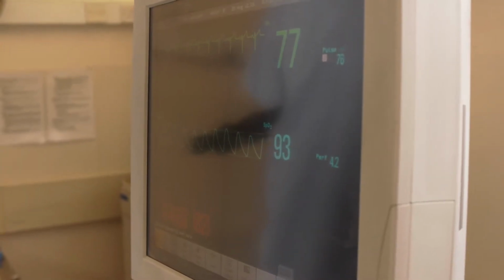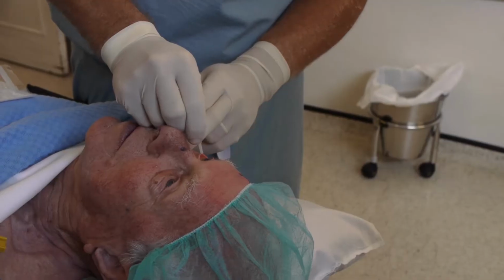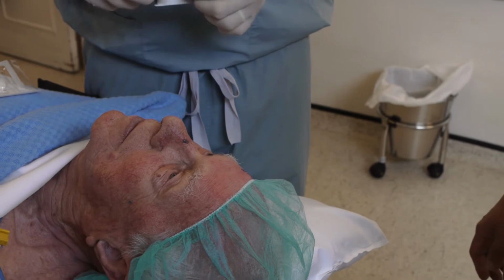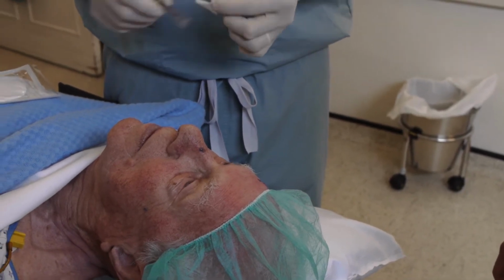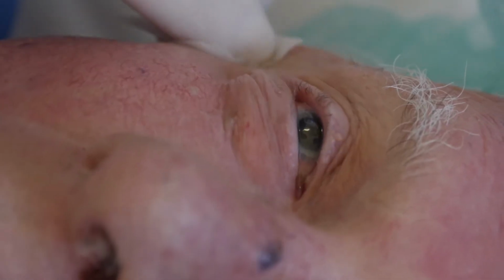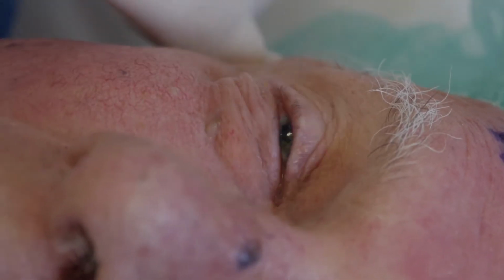For the peribulbar block, we attach routine monitors, a couple of drops of proxymetacaine in the lower eyelid as shown, and then I like to swab the skin with an alcohol swab where we're going to inject along the orbital rim.